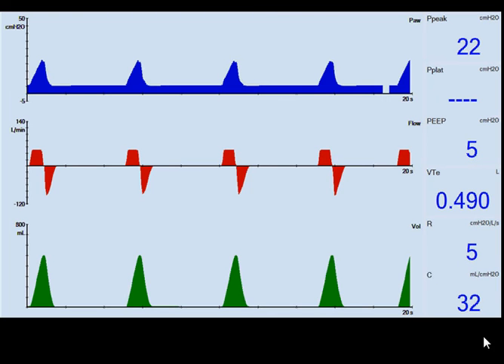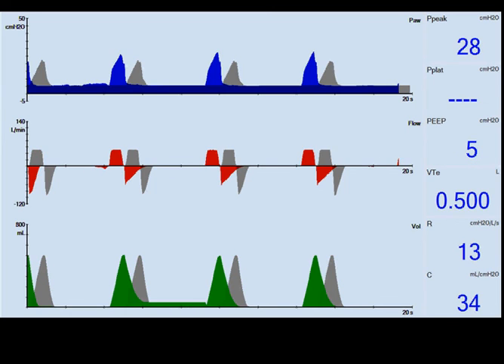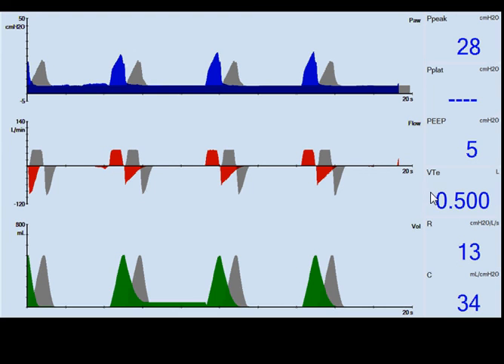Here is the baseline. We're starting with a volume-controlled breath. Volume will be constant up to a point where it hits a pressure limit. Peak pressure is 22, target tidal volume is around 500 cc's, and here is the flow waveform. The grayed-out baseline shows that even with changes in compliance and resistance, the flow waveform in red is very consistent. Peak airway pressure has gone up some, and the target tidal volume of 500 cc's is remaining constant.